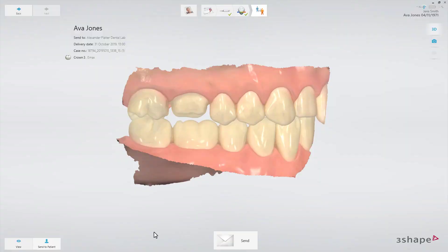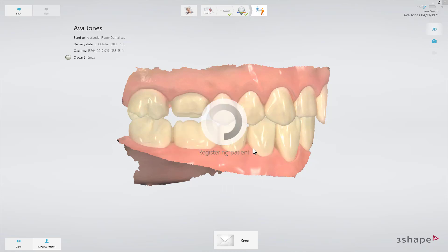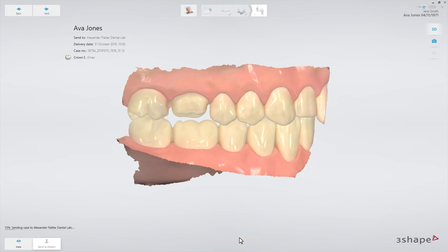The Send to Patient button, when selected, gives the possibility to send scans to the patient. If a patient's email was not set when the patient was created, you can set it here or change it, then click Select to save. When you click Send, the scans will be sent to both the lab or manufacturer and also the patient.